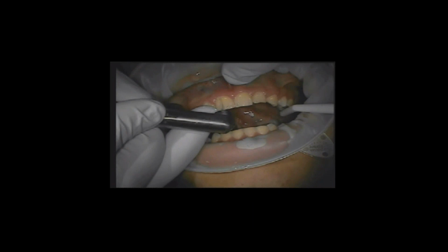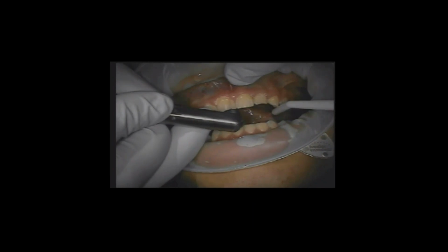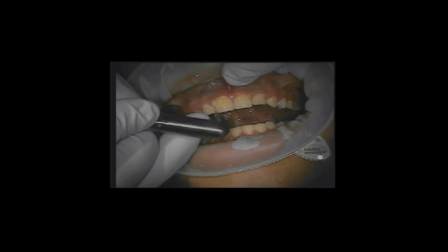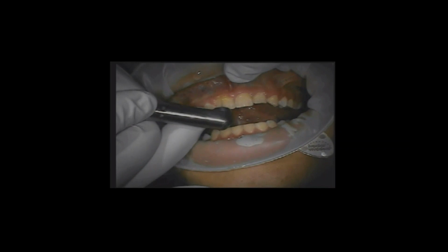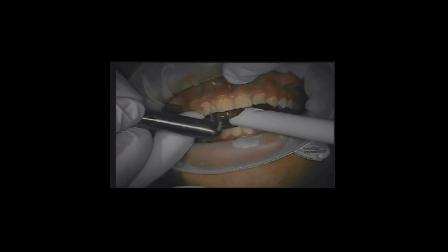So this is using the hand piece with that conical sapphire tip. We're parallel with the tooth. We're going to start at the zenith position where we want that to be. We've measured the pocket depth. And always start on the centrals because, again, they guide where everything goes in the arch as we work our way back. So idealize your central contours first, at least on one side, then you can work down that whole side and then move on to the other.